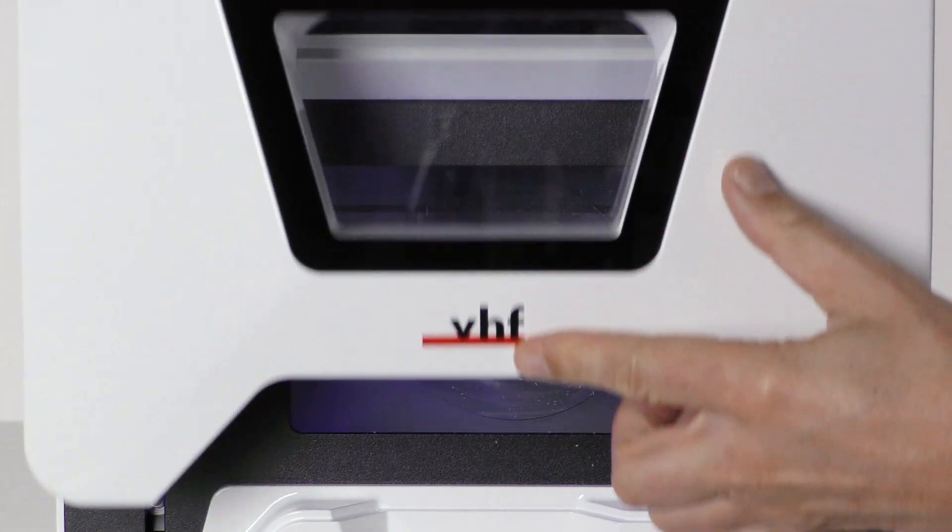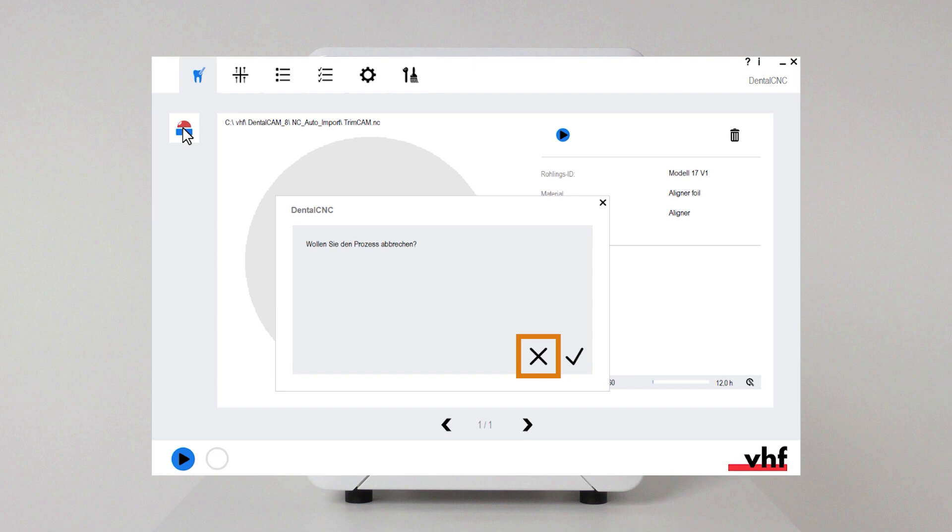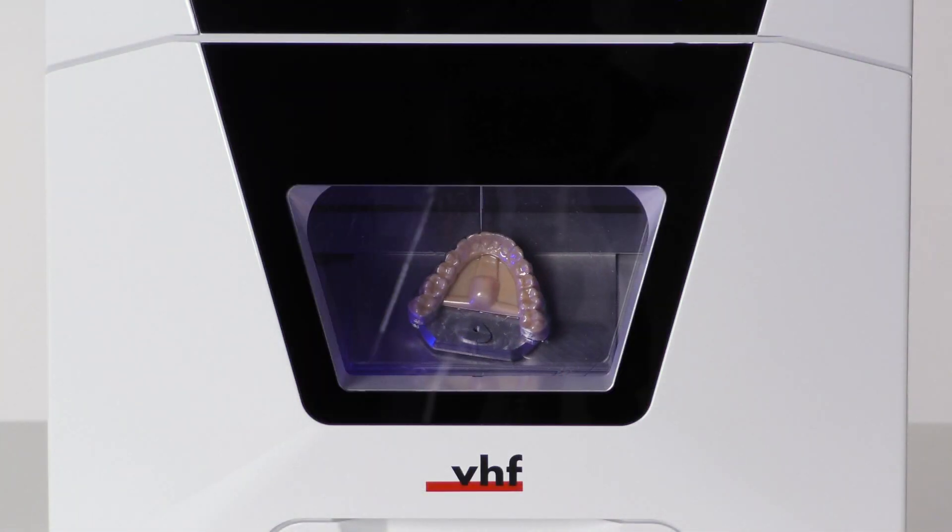To continue machining, close the working chamber door. Cancel the message in dental CNC. Machining continues.